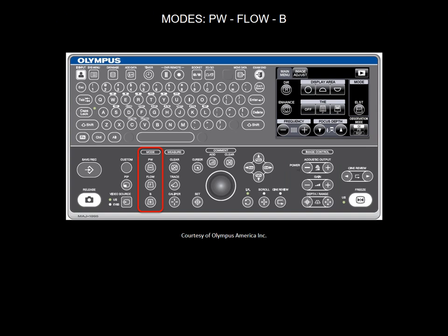Let's review now the ultrasound modes. There are three modes you can choose from. The B mode, otherwise known as the brightness mode. It displays a two-dimensional gray scale image on the screen.